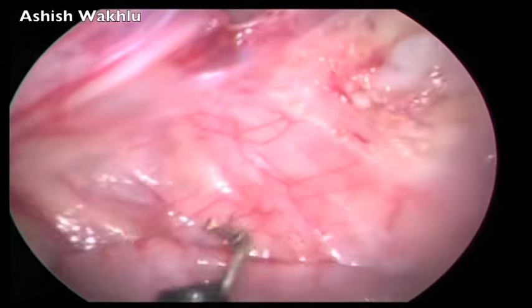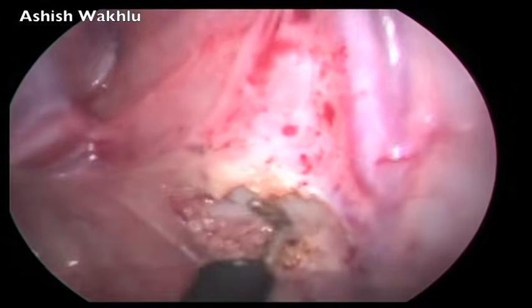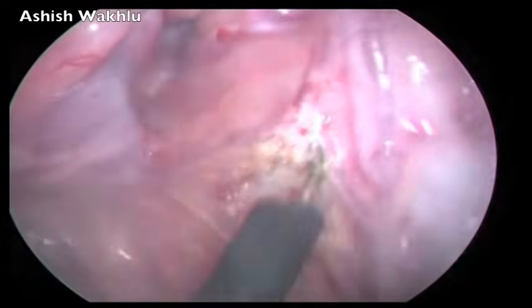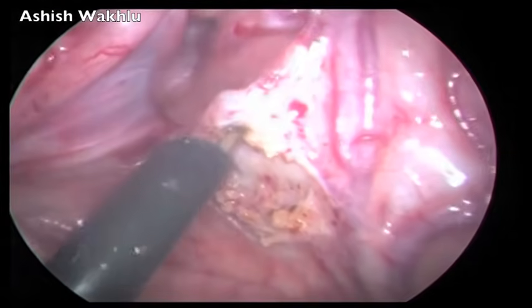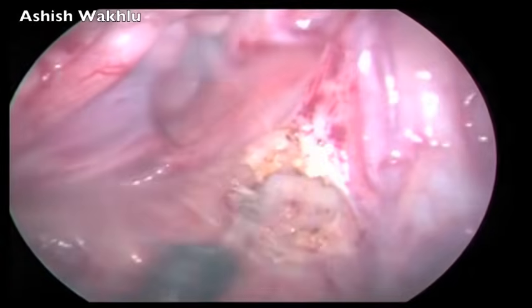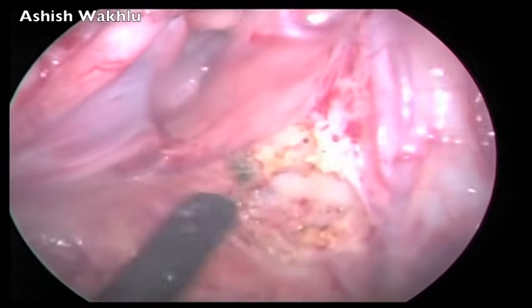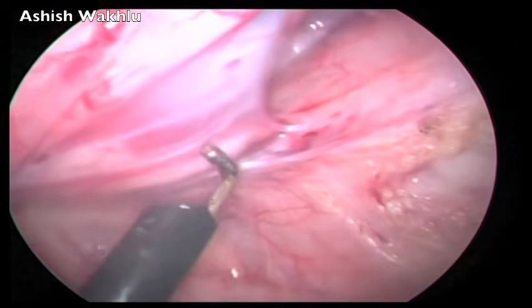There is the ureter of the left side, visualized through the sigmoid mesentery. This is not the usual situation in anorectal malformations, where the patient mostly has a sigmoid colostomy, that is the left vas deferens.